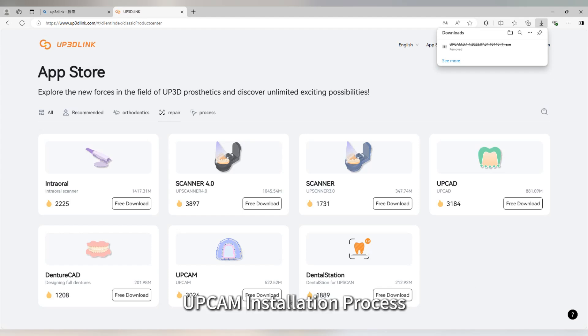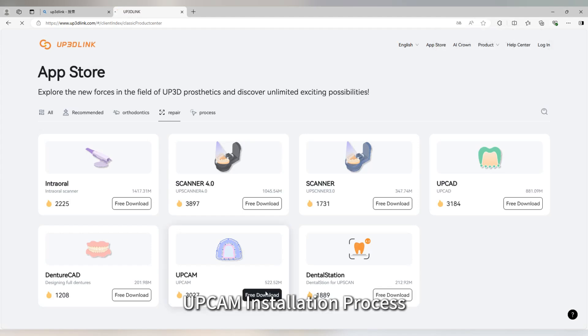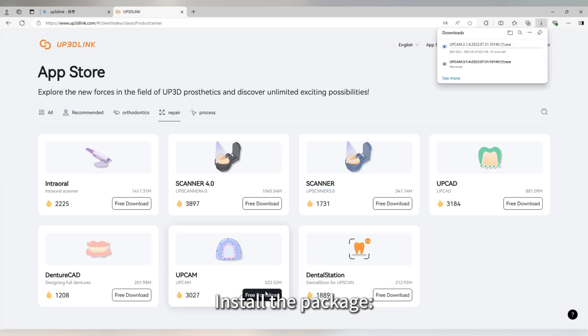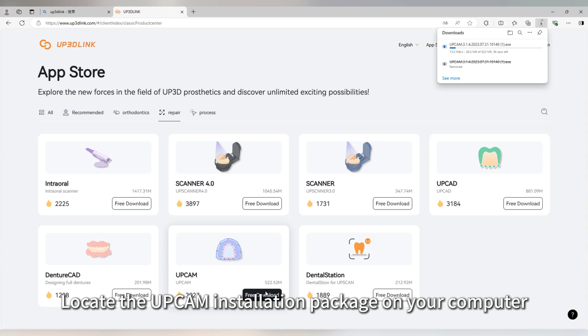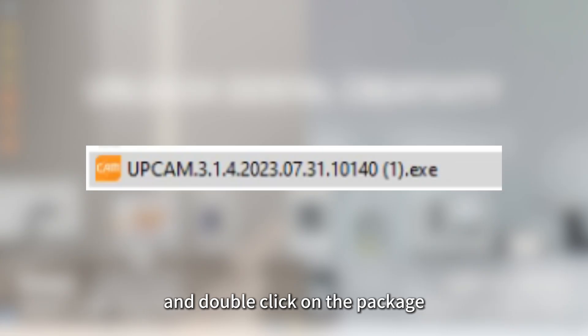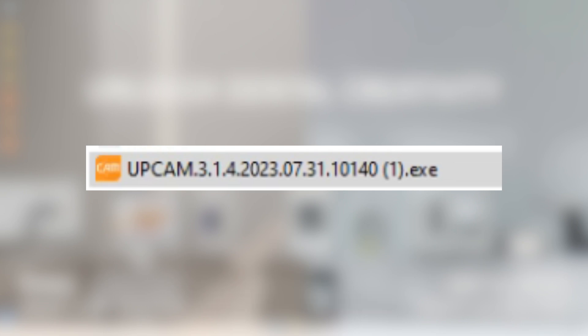UPCAM Installation Process: Locate the UPCAM installation package on your computer and double-click on the package to begin the installation.